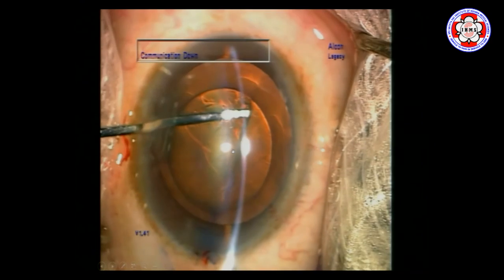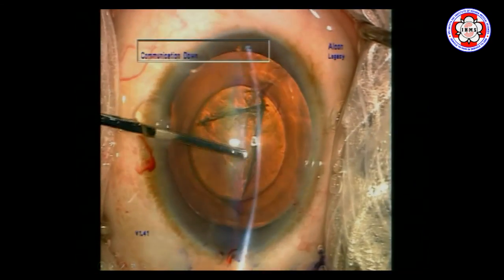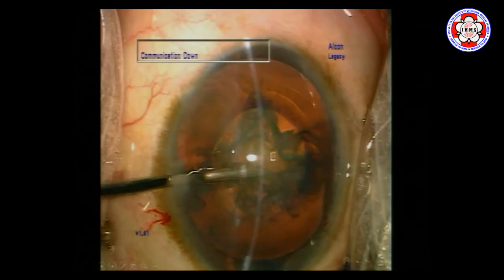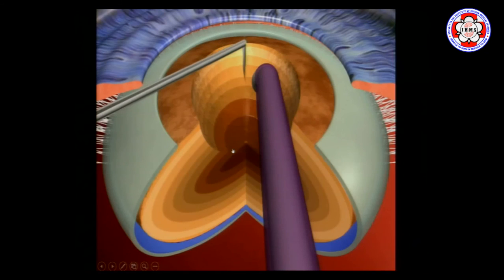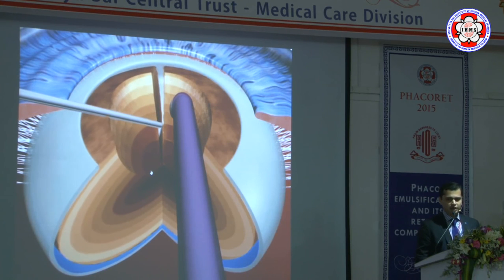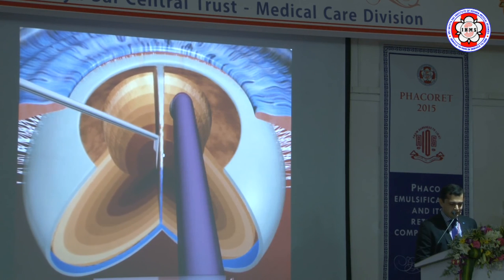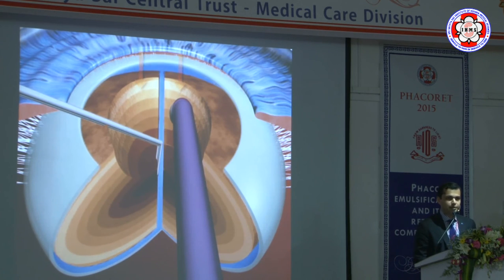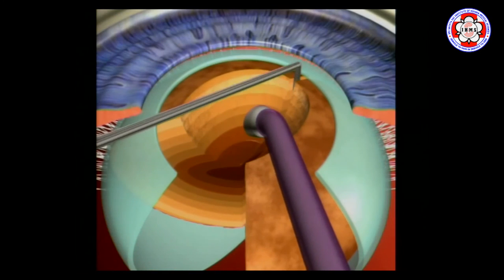At this point, any attempt to decompress the lens may not be possible because there is intraoperative fluid trapped, and if too much force is given it may cause a blowout rupture of the posterior capsule due to excessive fluid behind the lens. Rotation maneuvers will likely not be successful. A good idea in this case is to forget rotation and first divide the lens by whatever technique you are comfortable with. If it is a moderate density cataract, chop it — because once you create a cleavage plane, the fluid wave will find a way out into the anterior chamber, deepening it and making surgery more predictable.